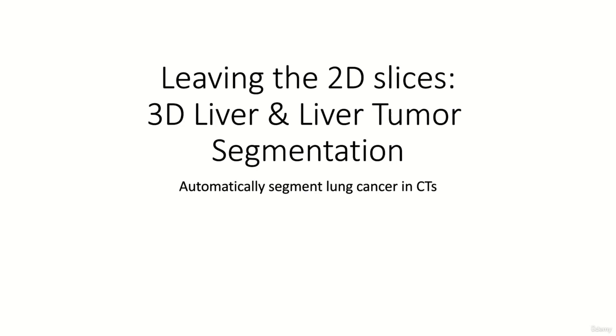Hello everybody and welcome to the last project of this course. In this project you will create a three-dimensional U-Net to segment liver and liver tumors in full-body CT scans. We will not work with single two-dimensional slices anymore.